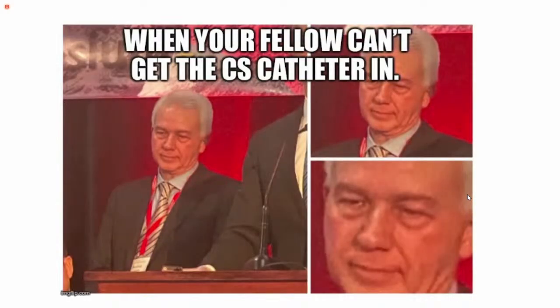Now, as fellows trying to get that catheter in, remember it's frustrating sometimes, not always that easy to get it in. I think it's a little easier to go from the neck, just another reason to consider that. But as you're trying to do it, you can see your attending just frowning at you as you're failing to get that catheter in.